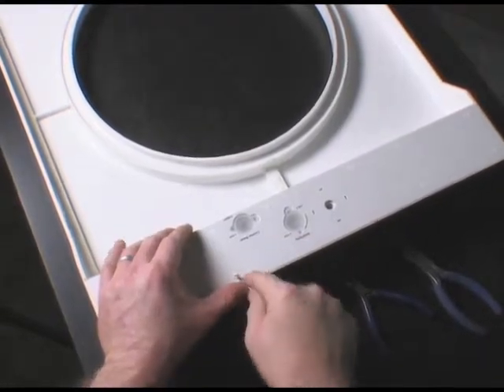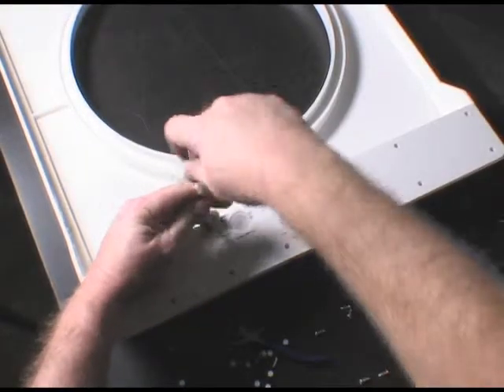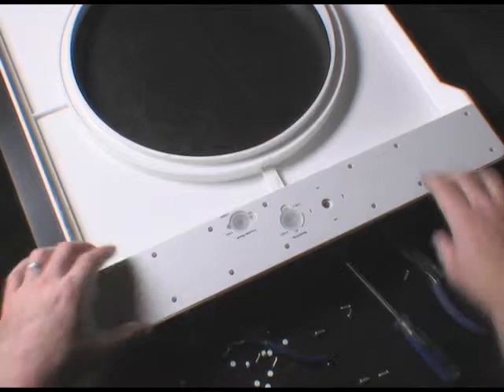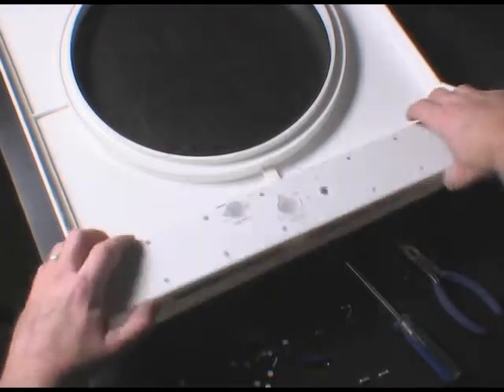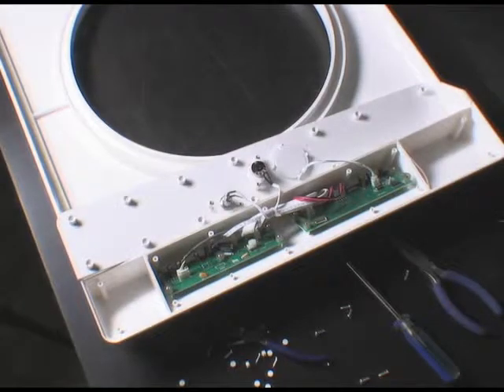This is done by prying open the small plastic screw covers and removing the 14 Phillips head screws. Once the 14 screws are removed, gently lift the bottom panel upward, folding it backward. Take special care not to pull on its wiring.